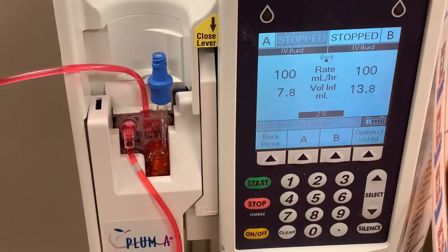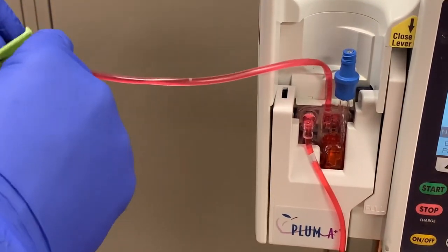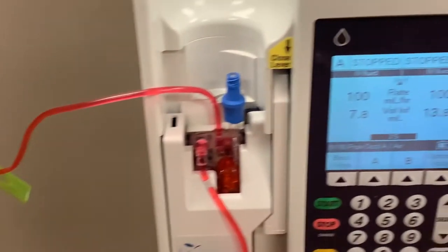Remember to unclamp your roller clamp. If you forget to open the roller clamp and try to start your B line, the pump will beep with a proximal air alarm. Go back, open your clamp, and press start on your line, and the medication should begin to flow.